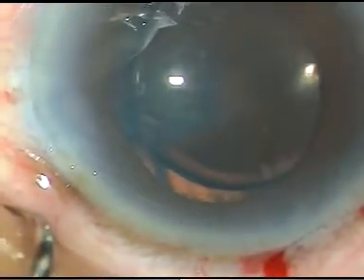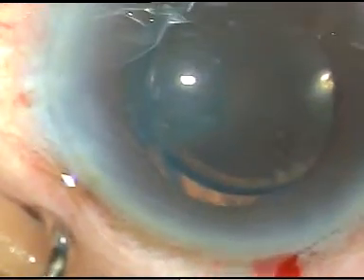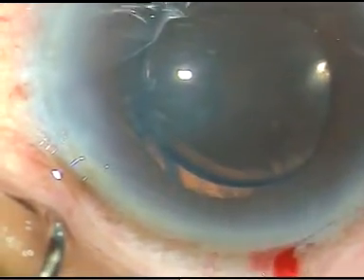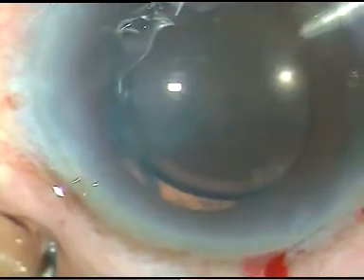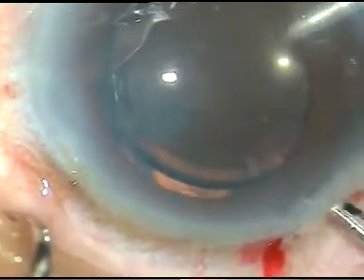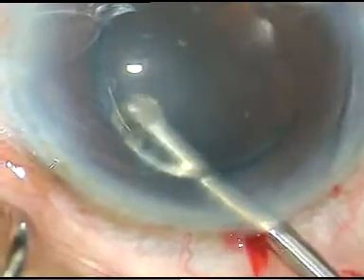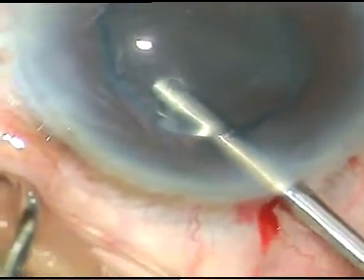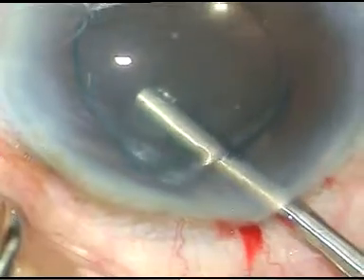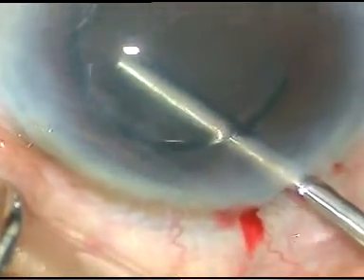Should I go behind the IOL and use the cutter to remove the cortical matter that I can see? Yes. So I have gone behind and I am removing the cortical matter that is behind the IOL.